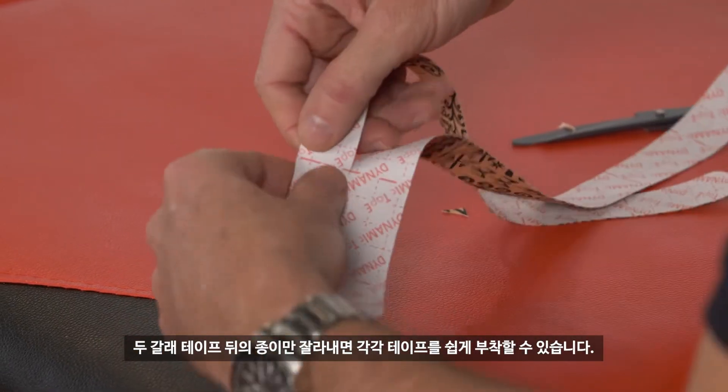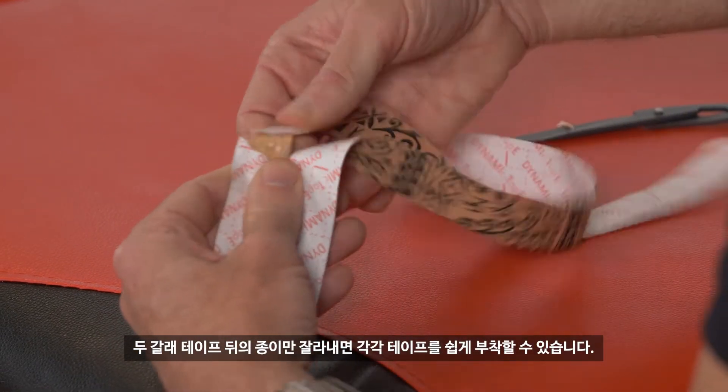Whenever you have separate pieces it's good to just tear the backing paper so they come off separately.